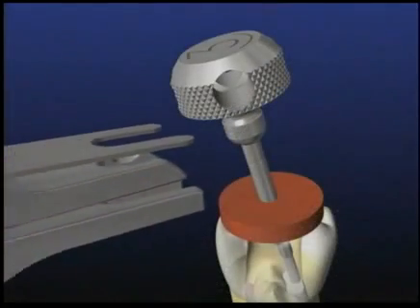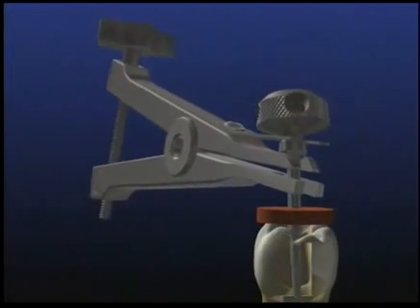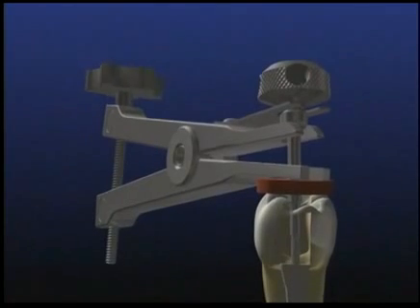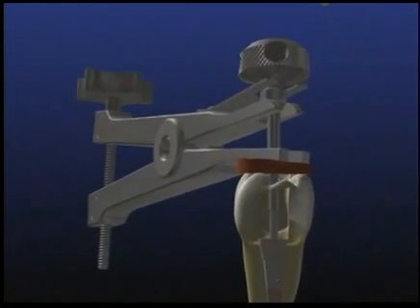Properly mount the extracting plier on the engaged tap. The screw knob is slowly turned and the jaws begin to open. Make certain the compressing cushion is properly protecting the tooth as the building removal loads begin to elevate the post.